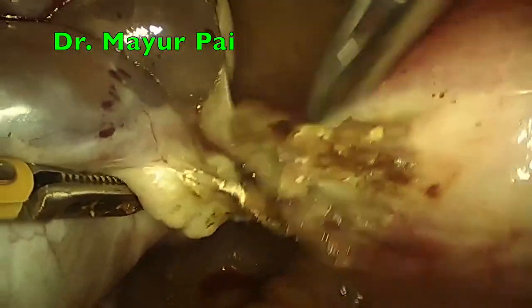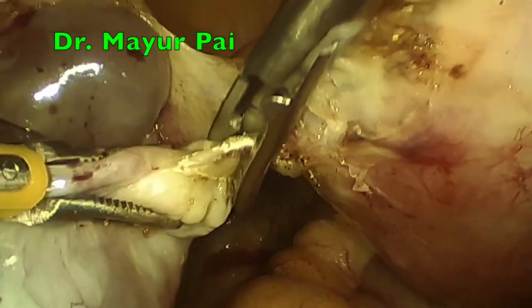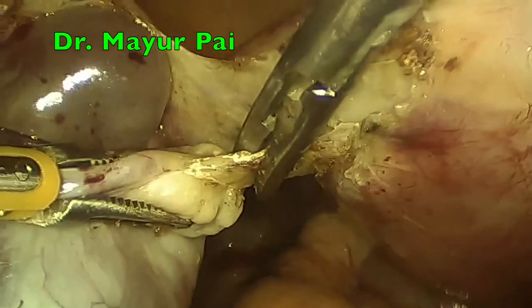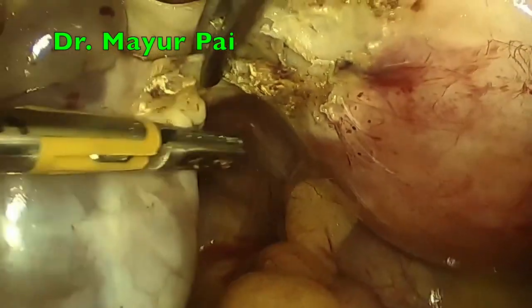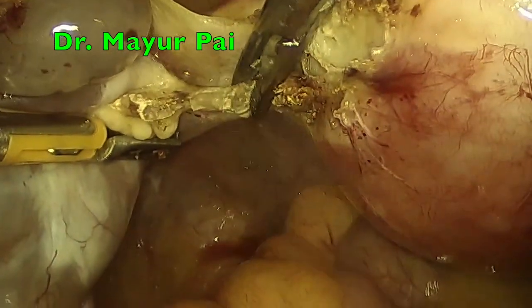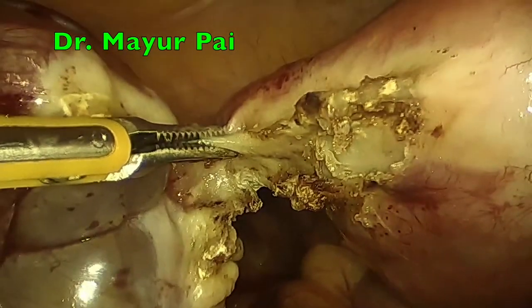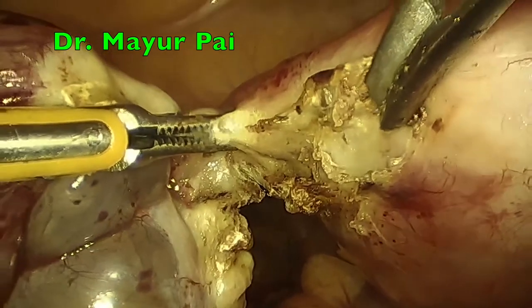So now that we have coagulated, we are going to cut with the instrument in the right hand, which is called the laparoscopic shearer. This instrument uses bipolar energy and it has the ability to coagulate as well as cut. This instrument is better at cutting than coagulating. However, we use the combination of a standard bipolar forceps with a low current along with the bipolar shearer, which is mostly at a high current setting, to do our dissection throughout the case.